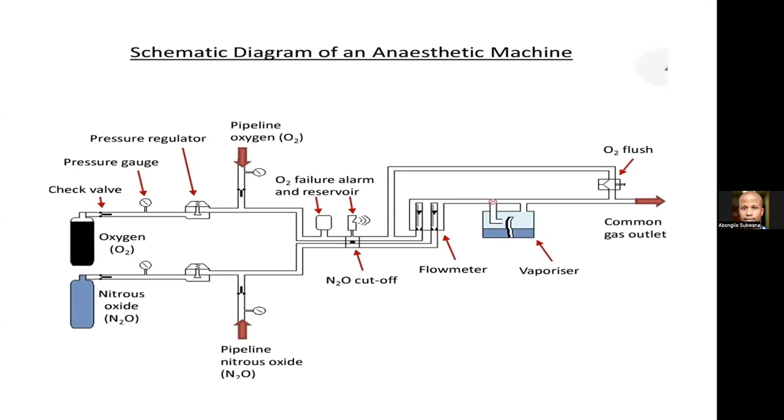So maybe it's 8, but divided into 2. So 4 will make one system, 4 will make another system. So only one will be supplying at a time. Once the pressure drops to a certain amount, an alarm will go off, so someone has to come and switch it so that the full cylinders can supply while they replace the empty cylinders. So you always have 4 cylinders as backup when the other ones run out.